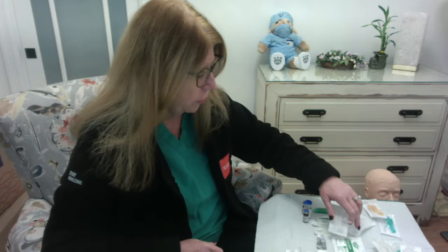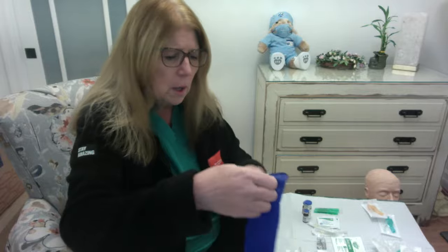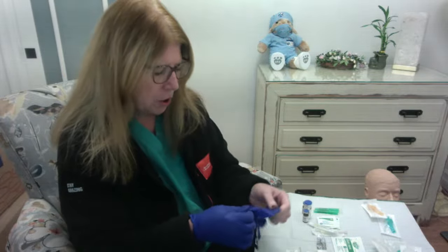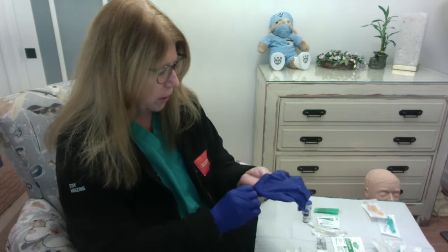So I want to start off with ampules and taking medication out of an ampule, and then taking medication out of a vial as well. So first and foremost, I'm going to do hand hygiene. I'm going to put some gloves on because I really don't want to get any of that medication on my skin, right? So let's look at an ampule.